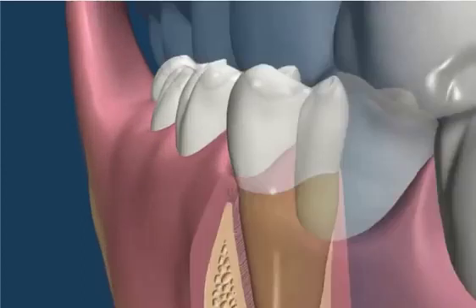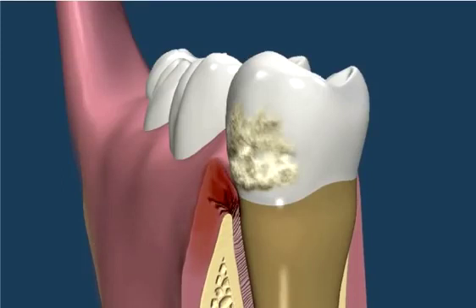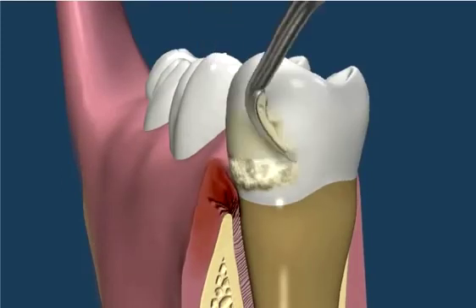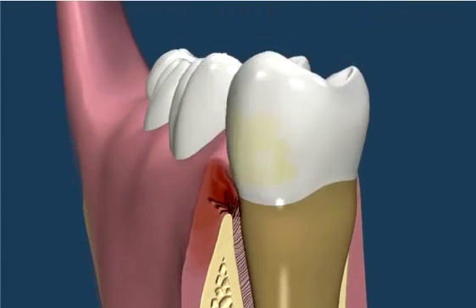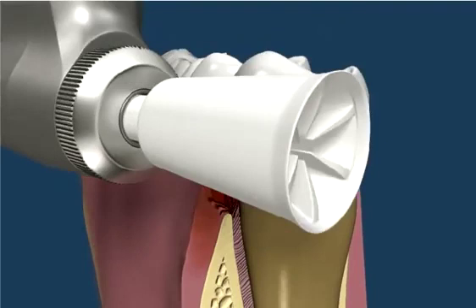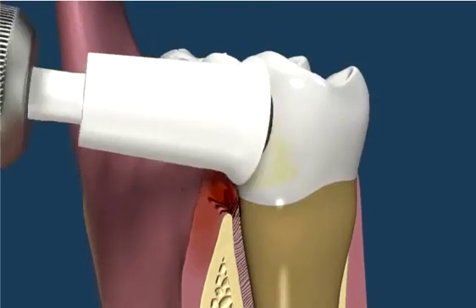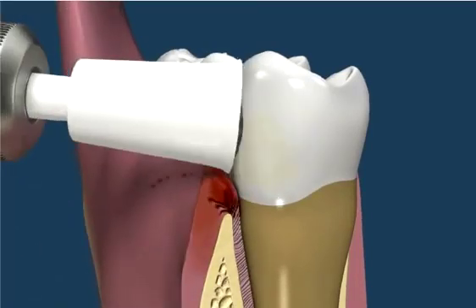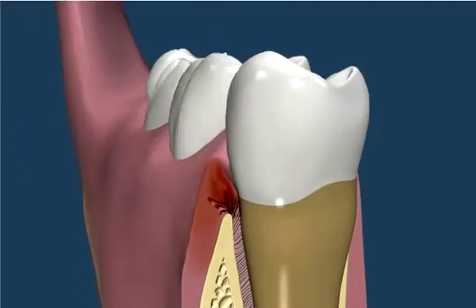This movie shows how the gingiva or gums respond to the accumulation of tartar and plaque. As a response to the tartar buildup on the teeth, the gums become red and swollen. The hygienist or dentist will remove the tartar with various scaling instruments, and then polish the area with a polishing cup and polishing paste. Without the tartar there acting as an irritant to the tissues, the gums will revert back to their healthy state.